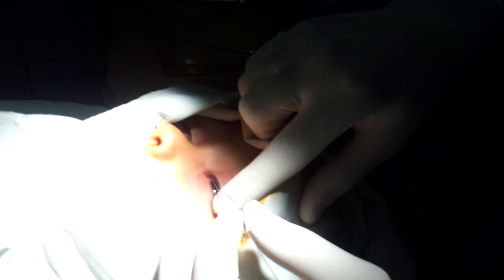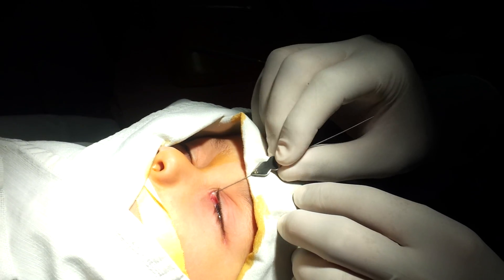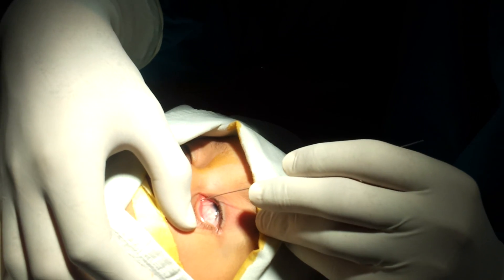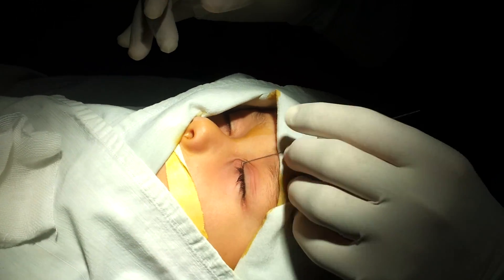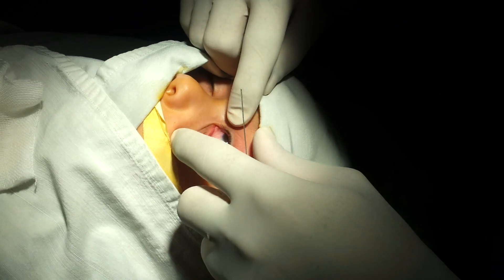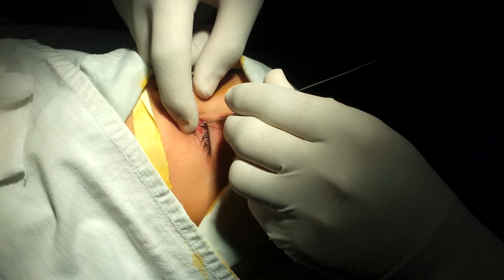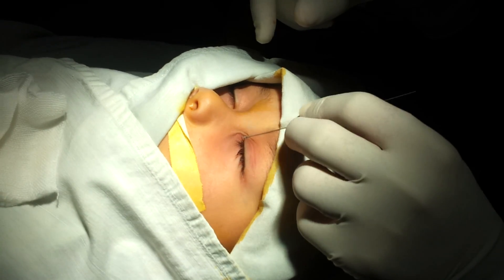We are going to do probing of both canaliculi. We get a hard stop, and then we go down the lacrimal canal. We feel the obstruction and then we perforate the obstruction. You have to be careful because secretions coming out from the lacrimal sac can hinder the visualization of the punctum, so you have to put the punctum in a good position so you can see it all the time. Hard stop. Down the canal.